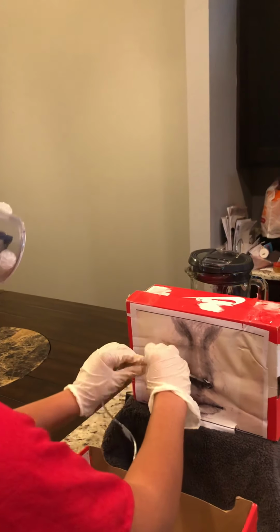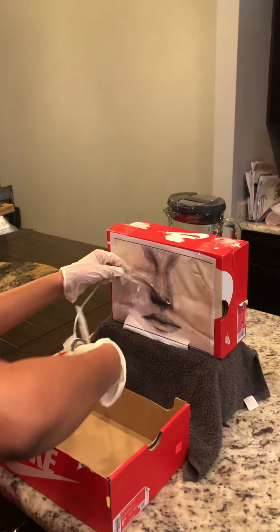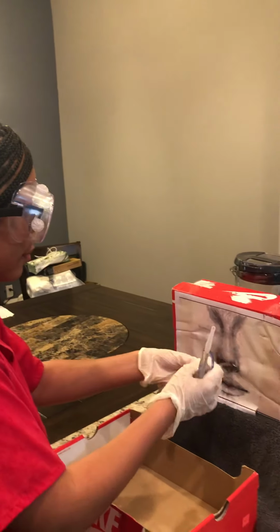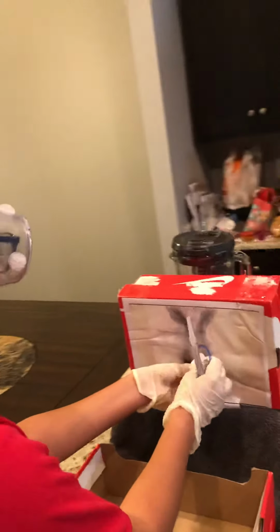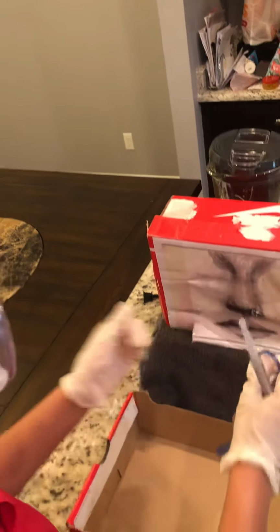Now demonstrating kinking back onto itself. I will remove my patient's NG tube both smoothly and steadily. I'll be sure to measure the drainage, perform oral hygiene, and document. Thank you, and this will conclude my skill.